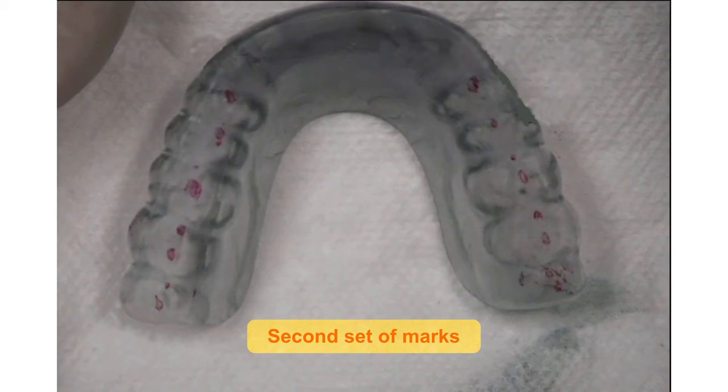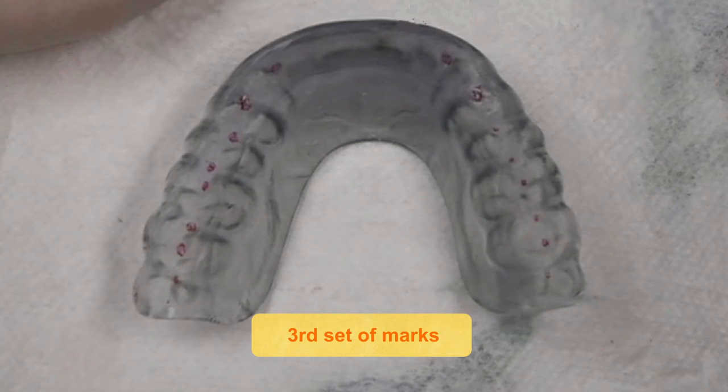So this is the second set of marks. They are adjusted in the same way, keeping the surface relatively flat and never ever touching the bottom of the VHF. The process is repeated, and then this is the third set of marks.